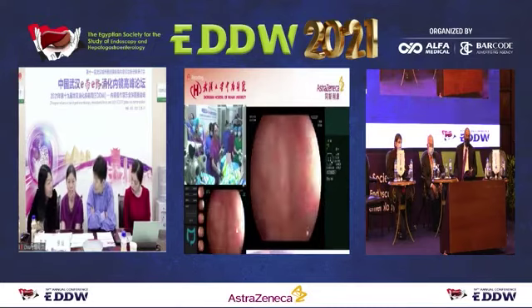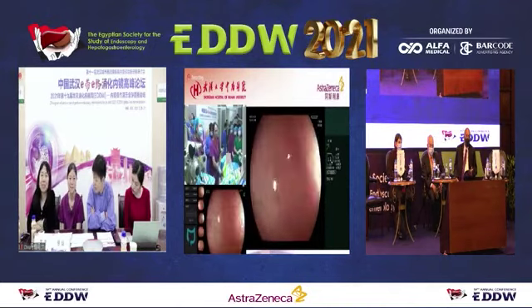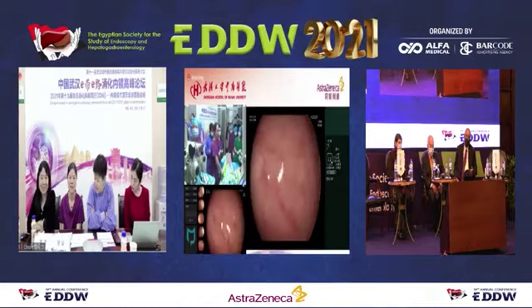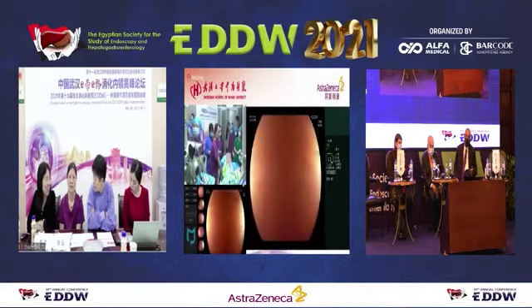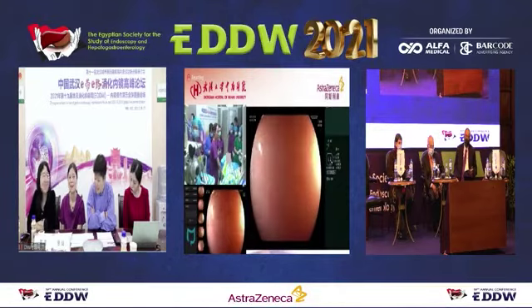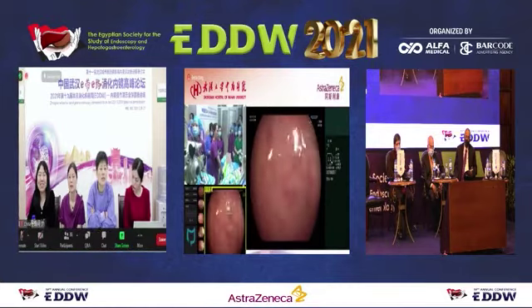If the suspected lesion is judged as malignant, the box will show red. So far we cannot see that.